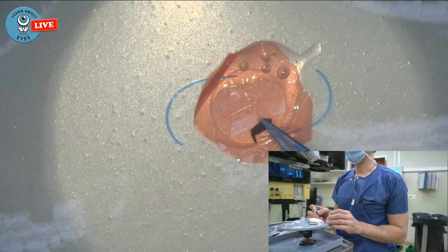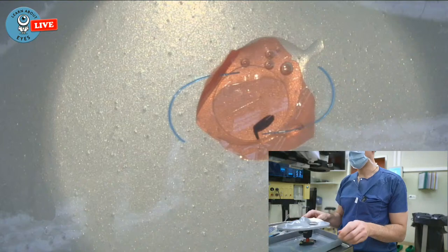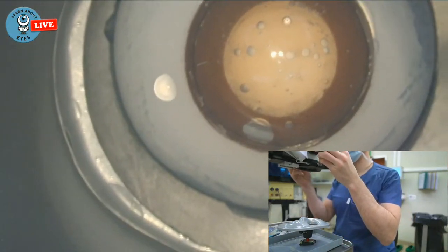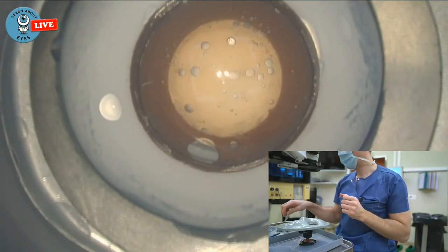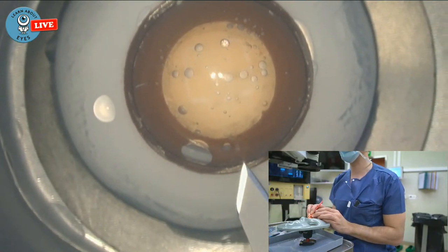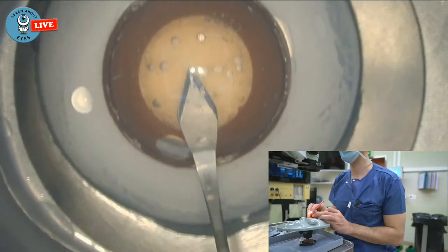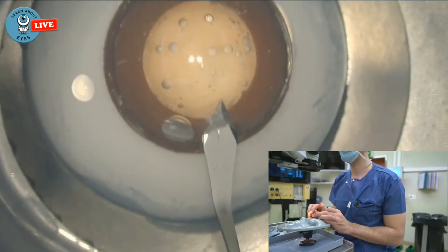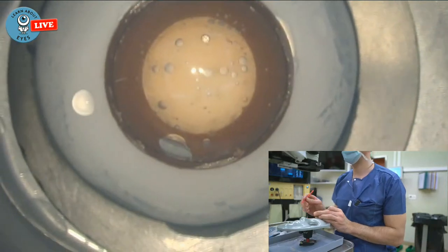Now, we kind of have to fold this without hurting it to insert it into here. So for that, first, just to make it easier, I'm going to create a bigger incision. Now, I've been using this knife for a month, so it's not really cutting all that well anymore. Let's see how this works.